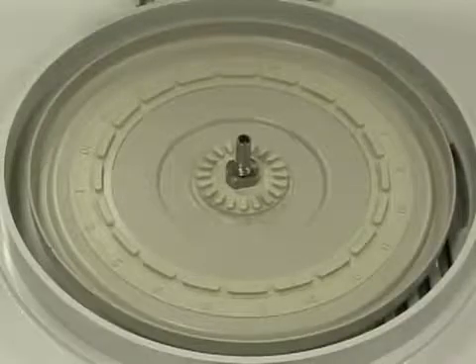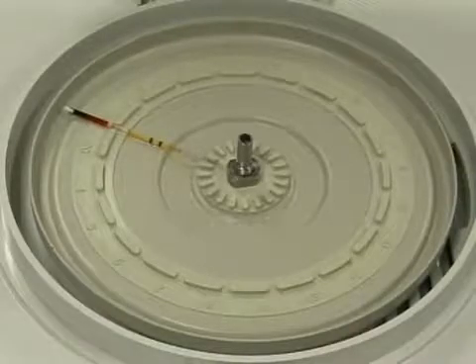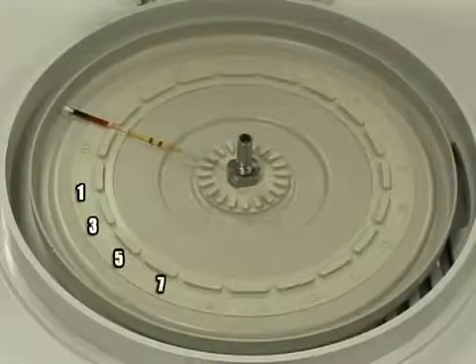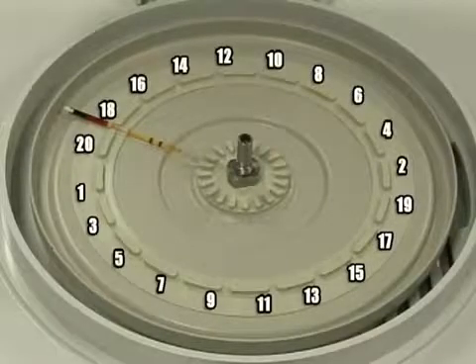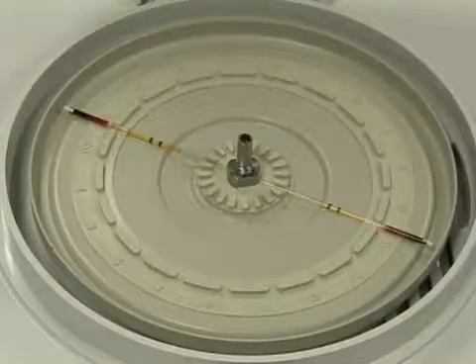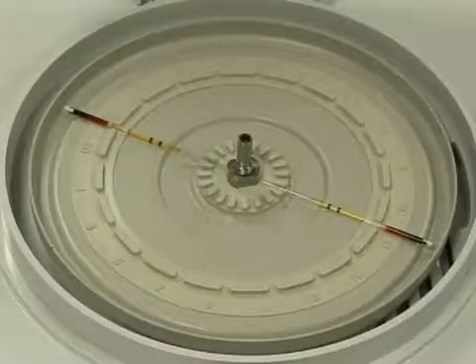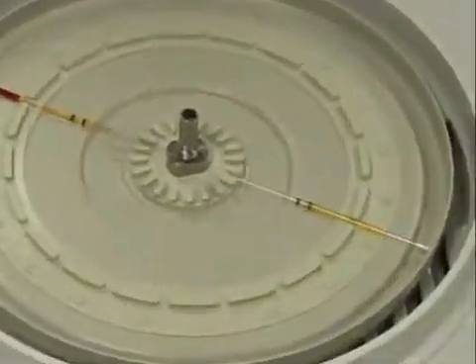Once a sample is loaded into the accutube, place the tube in one of the numbered slots. The rotor is numbered to assist with balancing the tubes. Always remember to place tubes opposite each other on the rotor. If there is an odd number of tubes, an empty accutube must be used to balance the centrifuge.